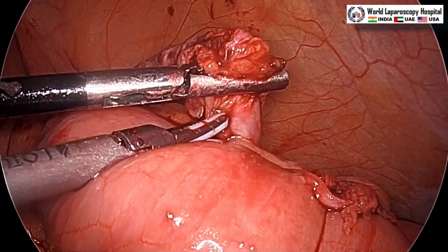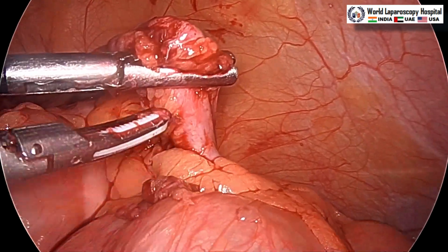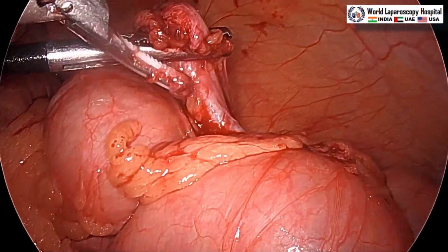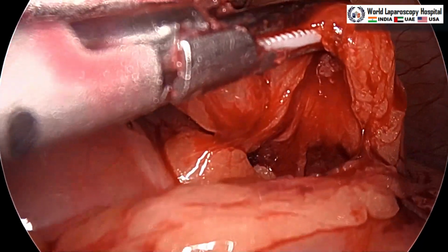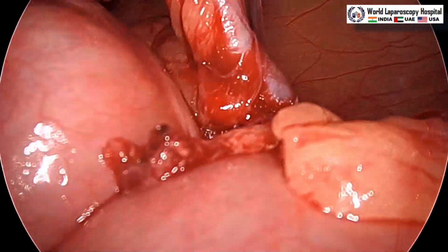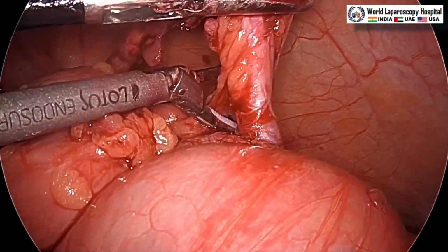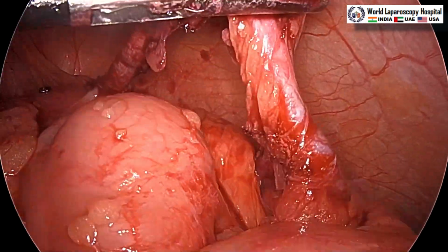We can see here on the right extreme, the lower lobe of the right lobe of the liver is visible. On the right lower corner you can see the right lobe of the liver, and then you have the gallbladder also. So, it is almost reaching the hepatic flexure of the colon. But luckily here the tip of the appendix was found, and then it was separated.